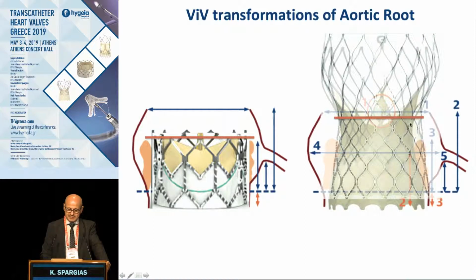When you implant a second Medtronic valve in another Medtronic valve, you have to move a little higher, but the leaflets of the first Medtronic valve, because it's supra-annular, they're really higher. So the new cage that is created and isolating the leaflets of the latest valve from the forces outside is going really higher. So in the first case, when we have valve-in-valve with a Sapien within a Sapien or within a CoreValve, nothing happens.